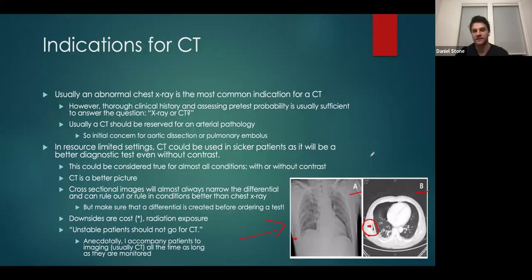My argument is that the CT scan is helpful in identifying this, but it also creates an incidental finding that we're not necessarily concerned about. We will talk more about incidental findings in a later lecture, but it's important to know that CTs increase the rate of incidental findings.